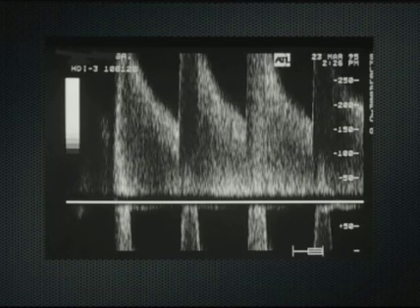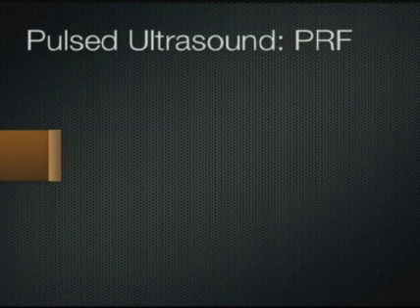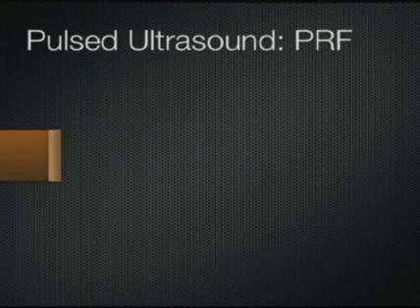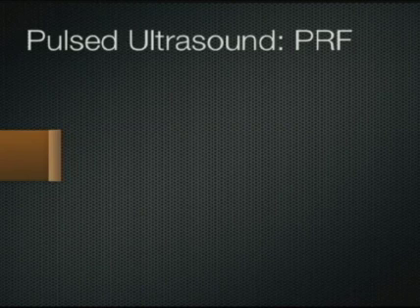With very, very high velocities, it's common to see a phenomenon which is recognized as aliasing. Here we can see that the highest frequencies, the highest velocities, are not displayed in the display, but wrap around and appear below the baseline. As you recall, ultrasound involves the use of brief pulses of sound, which are delivered at high frequencies. The frequency of these pulses is called the pulse repetition frequency and is often several thousand pulses per second.